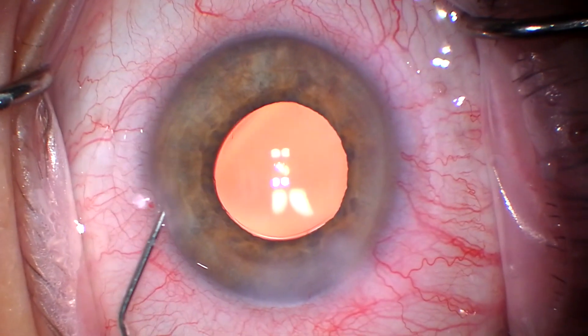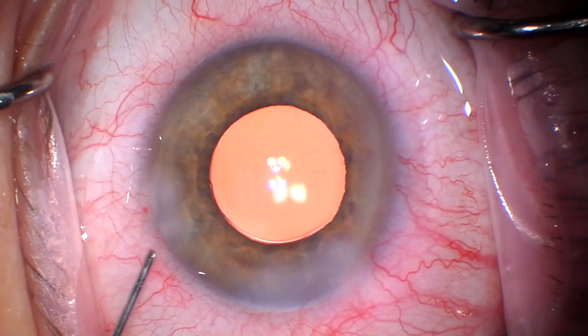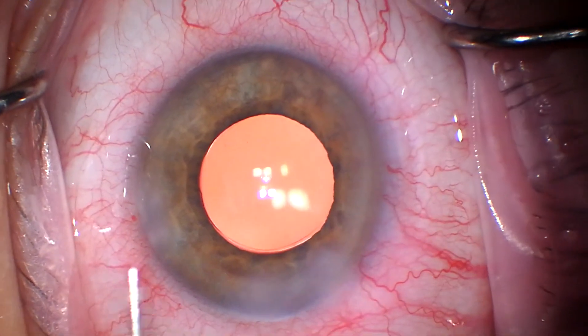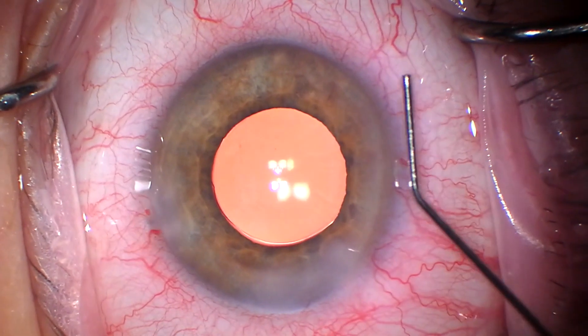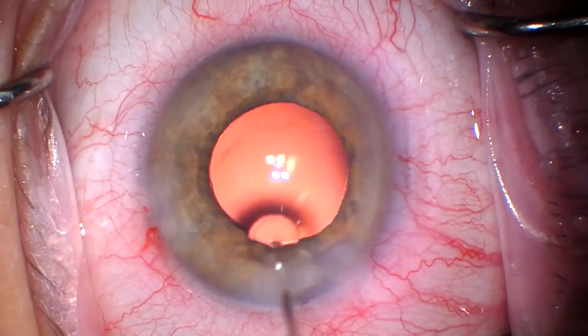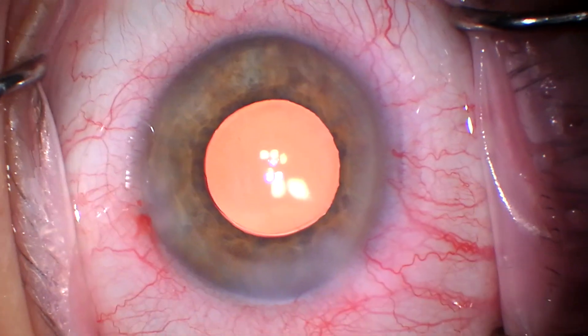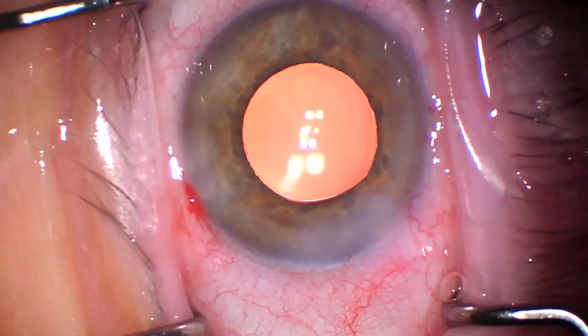This is just a real pristine way to do it. That's Cefuroxime, which I highly recommend — it decreases your endophthalmitis rate from one in a thousand to one in five thousand and costs less than a dollar per case. I highly recommend it. We get it from Cardinal and mix it ourselves off label.